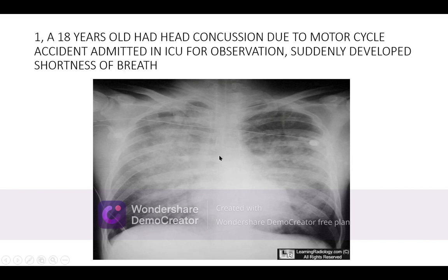The etiology is manifold. It may be just lying down a patient after a motorcycle accident, because of the head injury, a lot of changes in the other systems can be represented. One of these is non-cardiogenic pulmonary edema. Inhalation of poisonous gases, or inhalation of large amounts of external pollutants, can cause this type of non-cardiogenic pulmonary edema, as well as cases of near drowning.